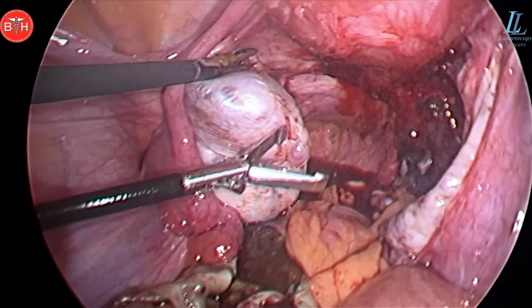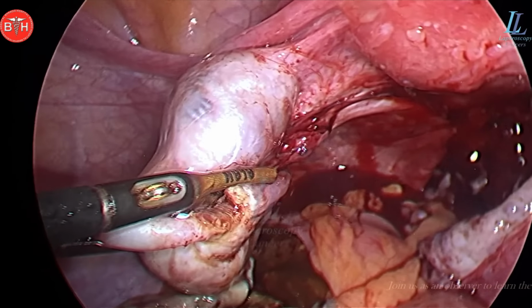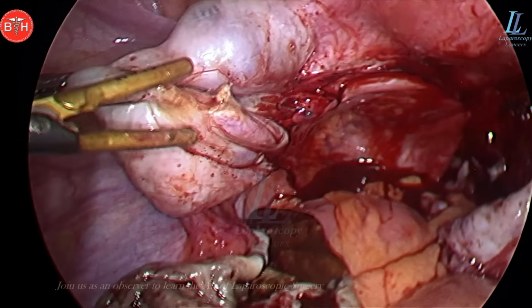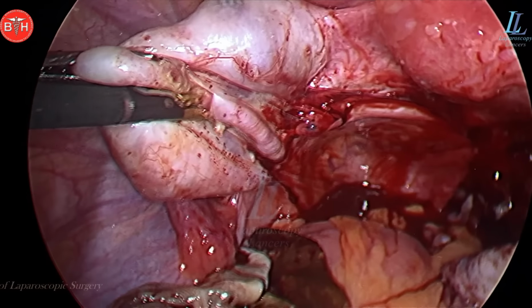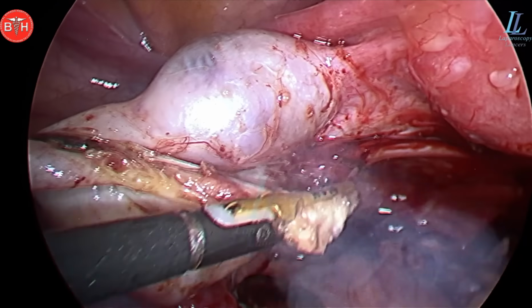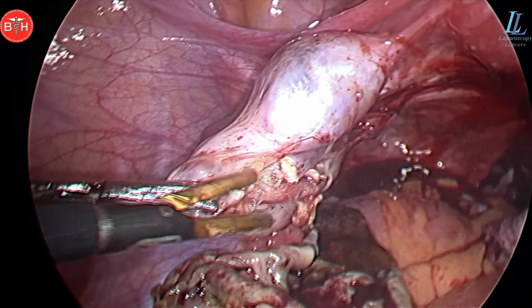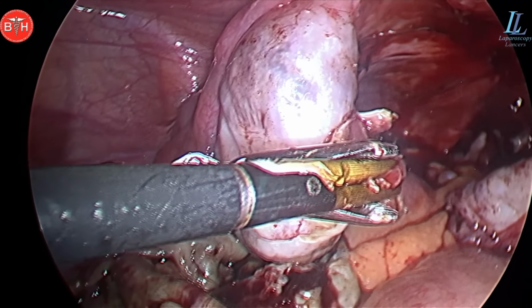Generally we use only 2 working ports, and please practice using 2 ports only. We are doing all the gynecological surgeries with 2 working ports only. That means you can say it's a 3-port surgery. Contralateral ports I've not been using since maybe 3 to 4 years, as contralateral ports cause a problem to your right shoulder and obviously to the camera surgeon, and even a strain to your back and the neck. So practice with ipsilateral ports only. The speed is the same, or maybe even you will be faster using ipsilateral ports.